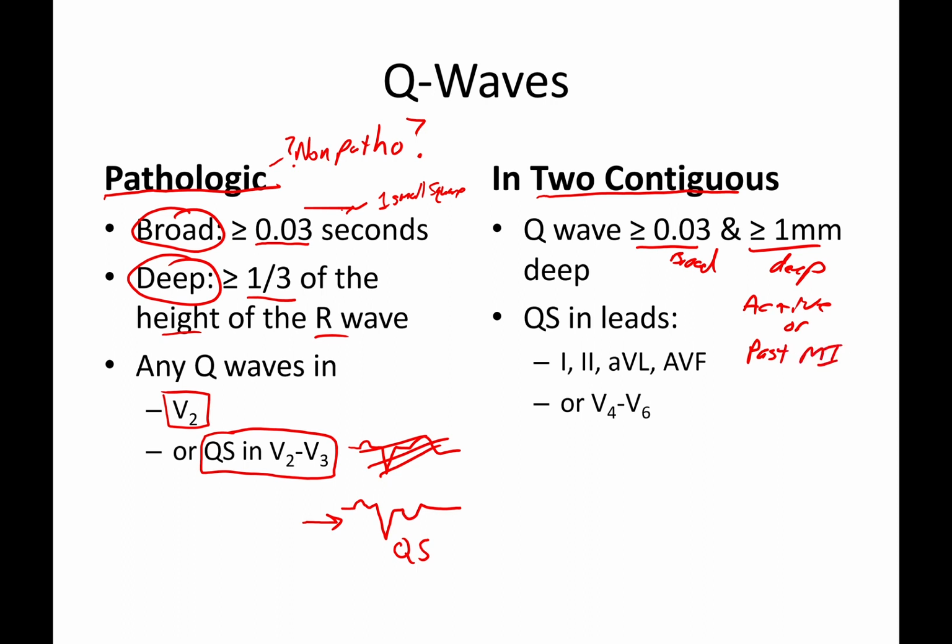And that's where you get people saying, oh, doc told me I had a heart attack, I never knew I had one. They're probably seeing Q waves on their EKG. That's a sign of a previous MI being present, because those will hang around forever, since you'll have that dead tissue, that scar tissue, in your heart forever. Also, if you have QS in any of these leads, that's also disconcerting and totally worth a look.